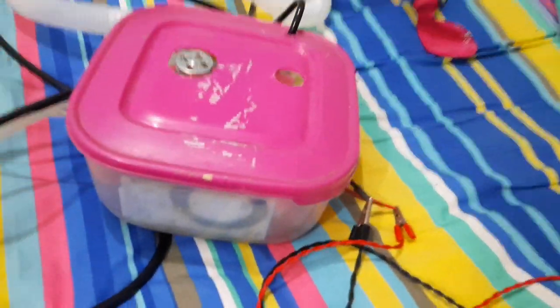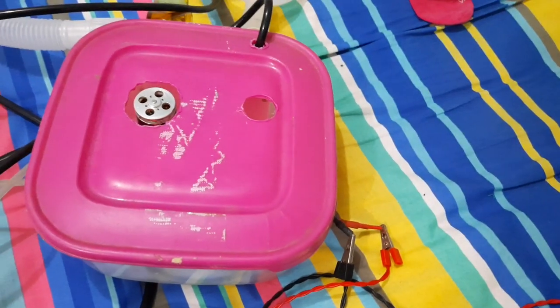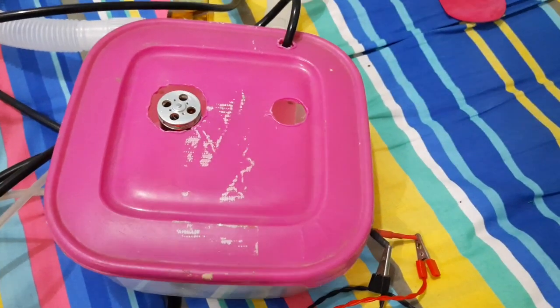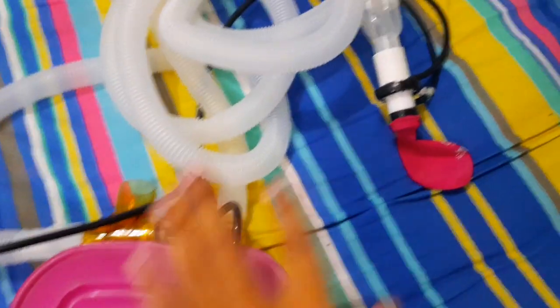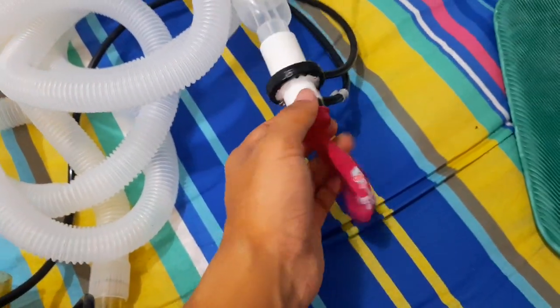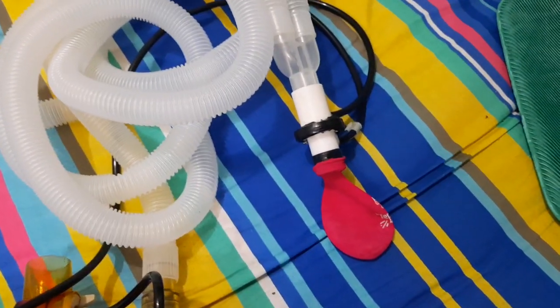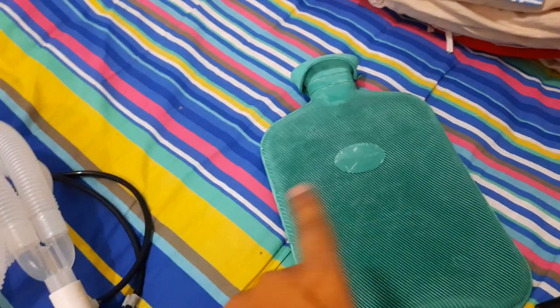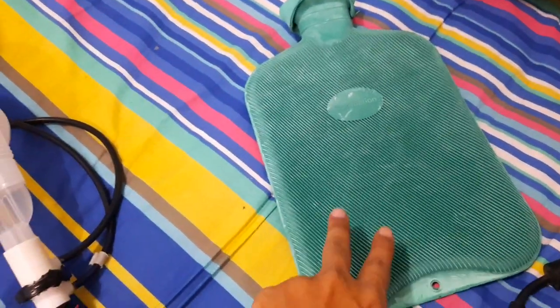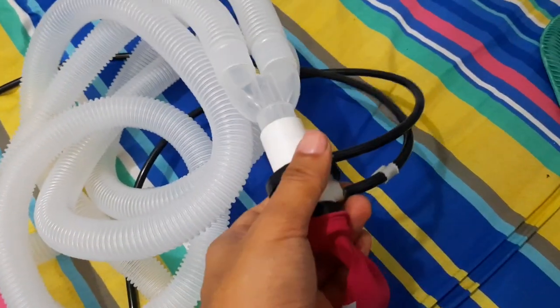This is the very early prototype of our ventilator, the CRUX Open Source Ventilator from Bangladesh. We will make all the documents, design, everything open source, so don't worry. What is here is just a balloon. This acts like a test lung, as I could not find any test lung in our country in this situation, so we have been using this balloon. The other thing we have been using is this hot water bag. This is the patient circuit, and this is the proximal air sensor.